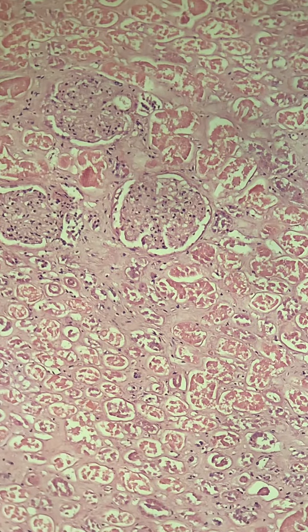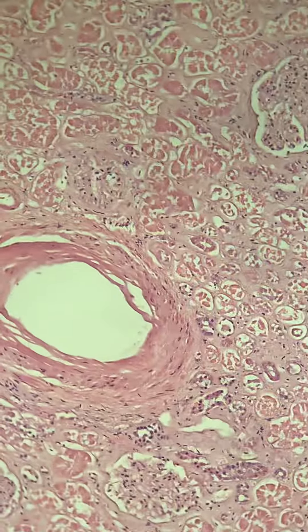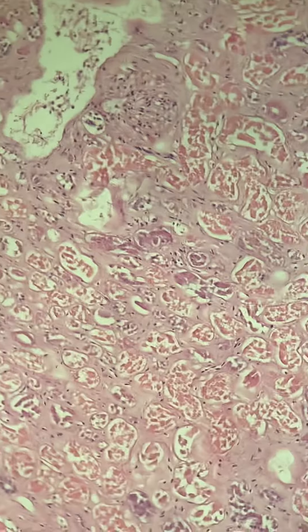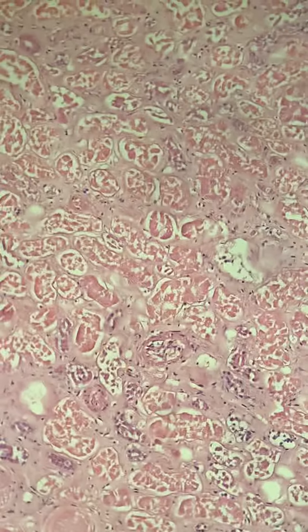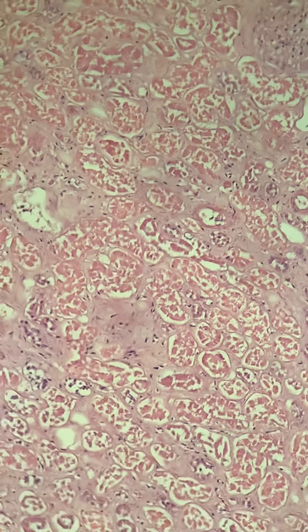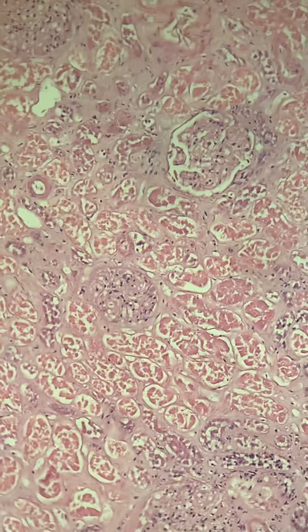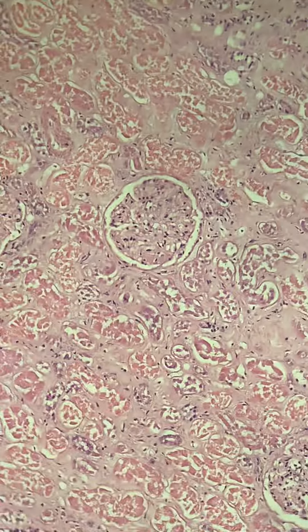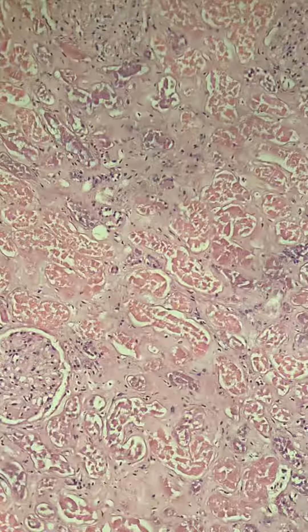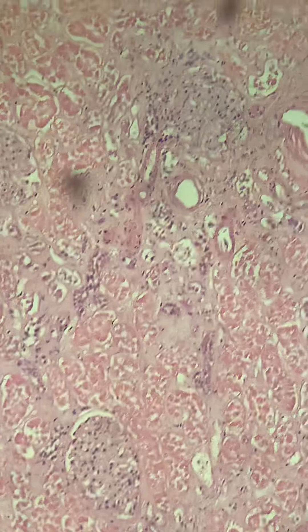Other than that, this is a relatively healthy kidney. There are some hypertensive changes around the vessel too. This extensive acute tubular necrosis — all that pink stuff you see in the background, those are renal tubules and they're necrotic from sepsis and low flow of blood from septic shock. But the glomeruli are intact, relatively speaking. Not much in the way of inflammatory changes that you most often see with chronic kidney disease or inflammatory kidney disease.